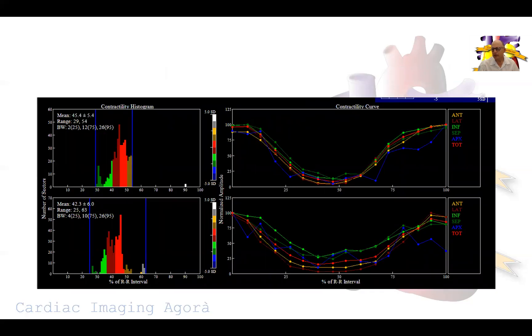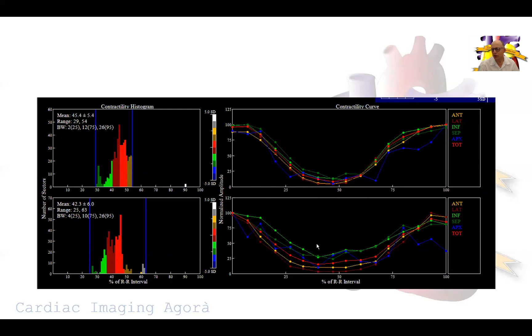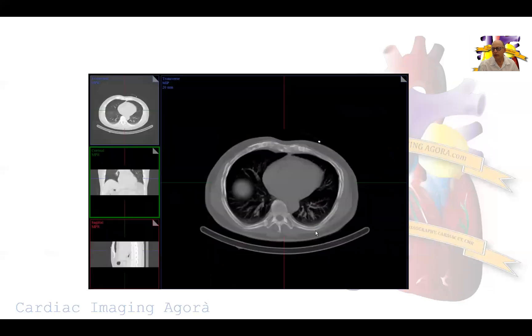Looking at synchrony: on the stress synchrony, all the ventricular segments are contracting at the same time. There is a bit of disorganized contraction at rest — we will talk about this in a few minutes. Then we look at the CT images. This patient had no coronary calcification, and the lung fields look okay, which we assess for coronary calcification and extracardiac findings.